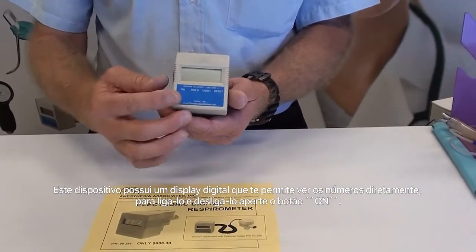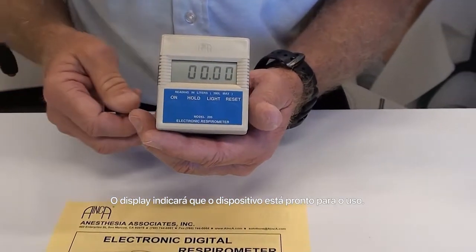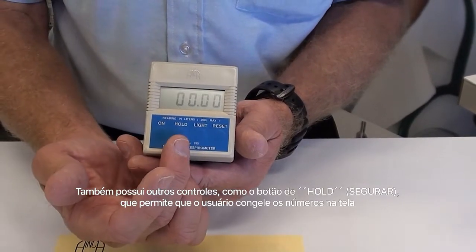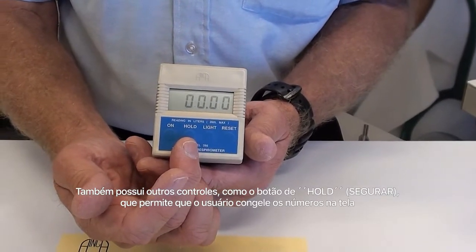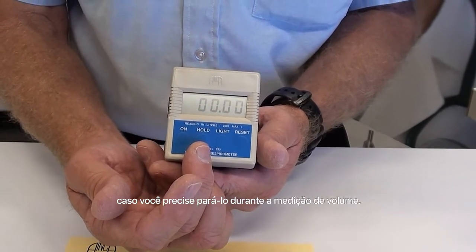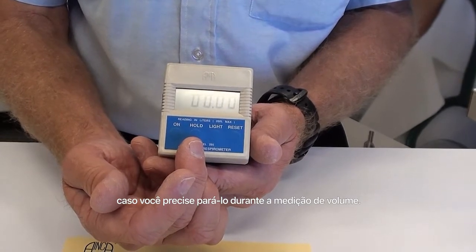To turn the unit on, you press the on button. The display will indicate that it's ready to go. There are other controls as well, including a hold button which allows you to freeze the display during the course of your measurements — if you need to stop during a tidal volume measurement or some other minute volume measurement.